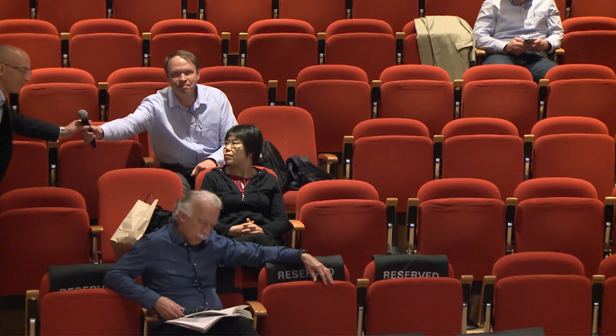Right, so that's a great question. For this particular tissue and for TMA, I'm a real stickler on antibody validation. I've published extensively on antibody validation, on how non-validated antibodies can lead you astray as well as provide good information. And so when Nanostring was putting together this panel, I was really challenging them on making sure that they were using validated antibodies.